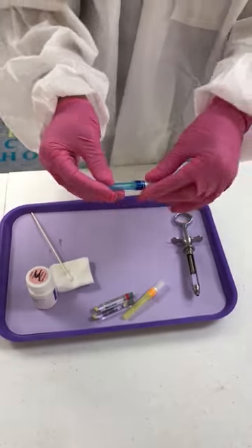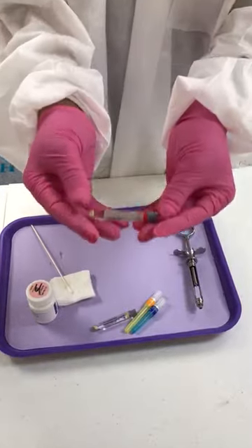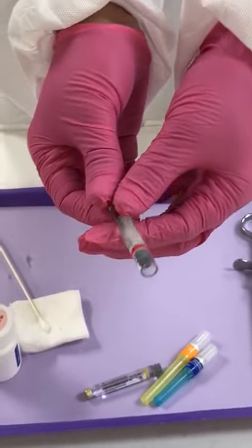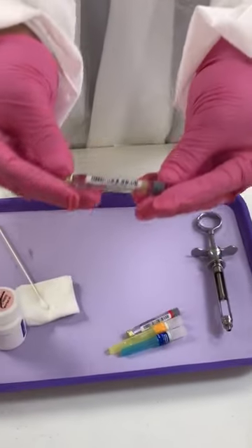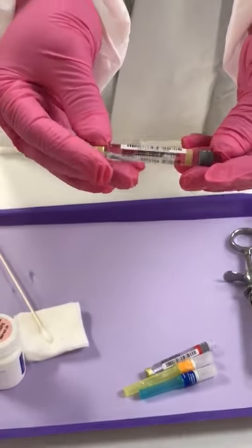When we talk about anesthesia, this is called lidocaine. Usually lidocaine has a red strip and it has epinephrine in it. This here is called carbocaine. Carbocaine is non-epinephrine.